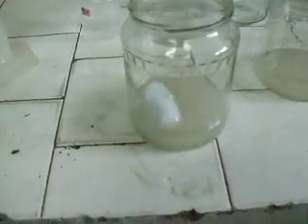Yes, the magnet fell out. I should have taken it out. Well, this is our way of dissolving guar gum.